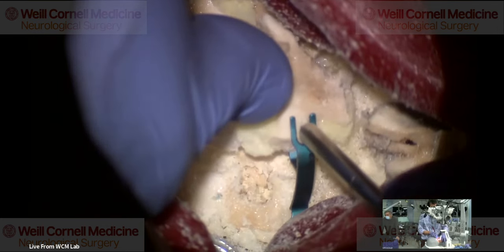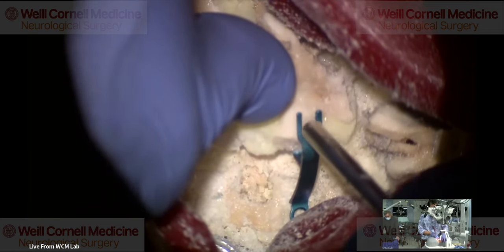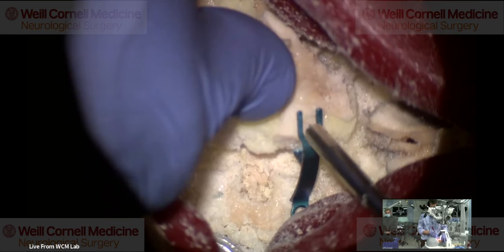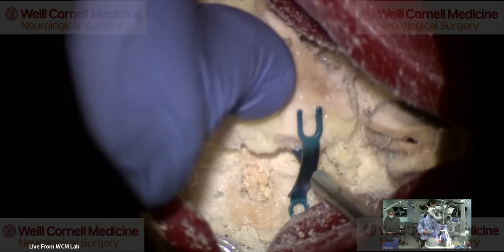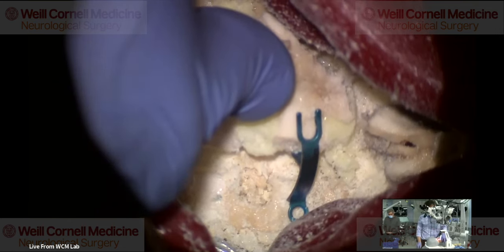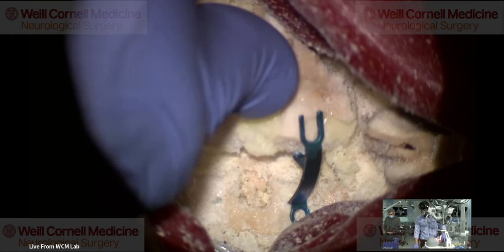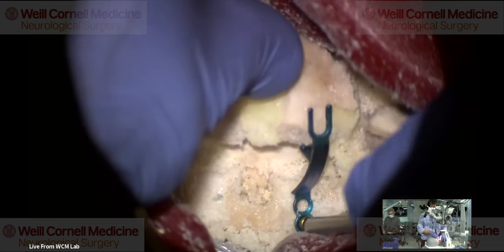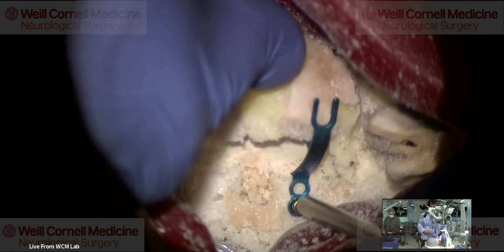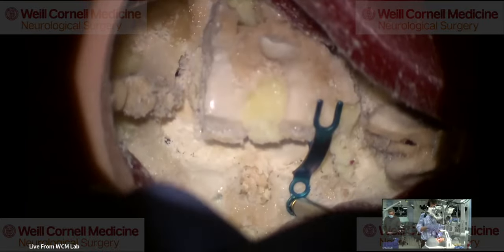Thank you so much. But I think that if you don't have a little drill that you use, because I use a 2.5 and a 1.5 drill, you can just do this before you do the trough and before you do everything. That way, it's a pretty easy way of doing it. I typically don't do that, but I would say that's probably the safer and the better way to handle it. And so let me just finish putting the screw in. And as I said, one of the things about these screws is the screwdriver has a really good bite, so it doesn't tend to fall off.